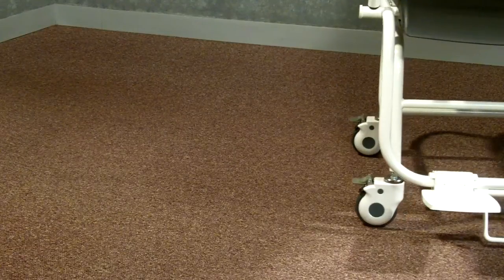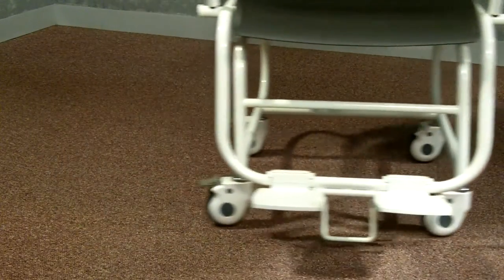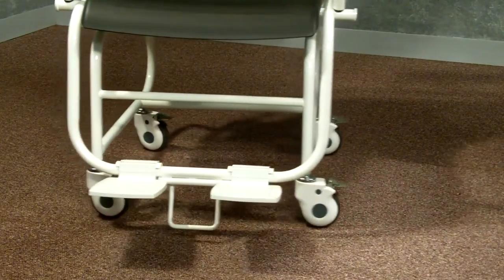Most chair scales in the market today only have two swivel casters. We've put them on all four corners to ensure the safety of the patient and ease of movement in tight spaces.